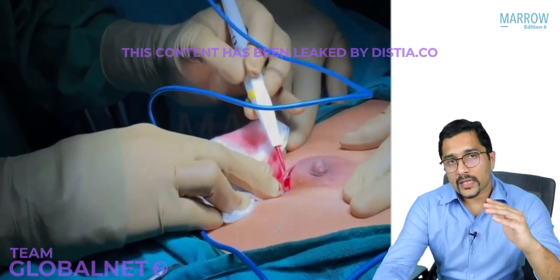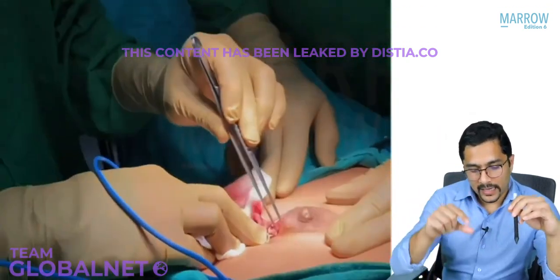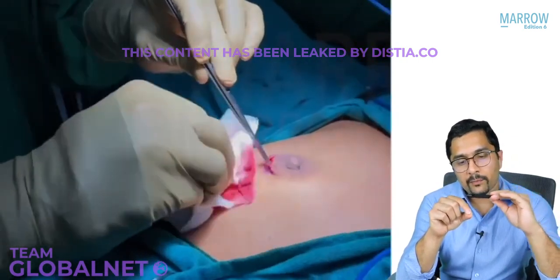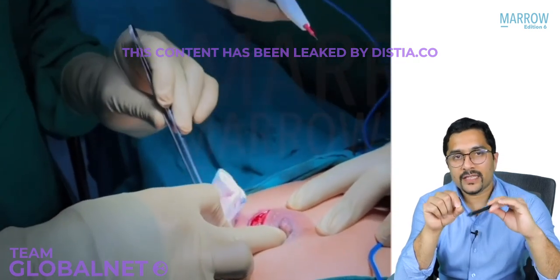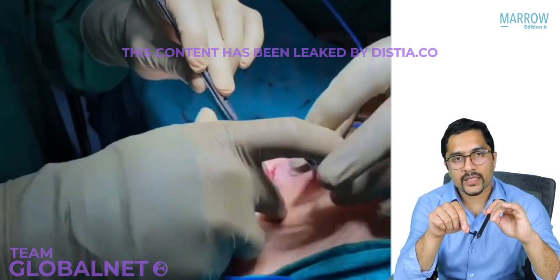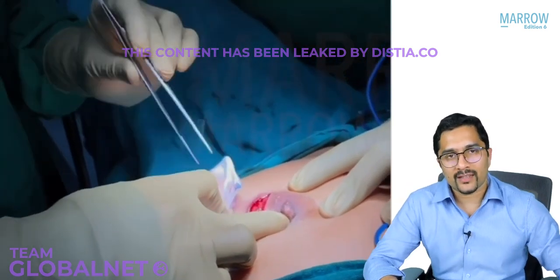Now once I do that, and if there is bleeding, then I can press the blue button and I can stop the bleeding. Now one more way to stop the bleeding is that I can use a forceps to pick up the vessel, and the nurse can touch my forceps. And even by doing that, the vessel will get coagulated, right? So there are two ways. Either you directly press it on the vessel, or you can hold the vessel with the forceps and then you can touch the forceps with the coagulating current.